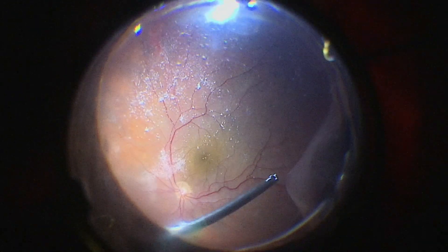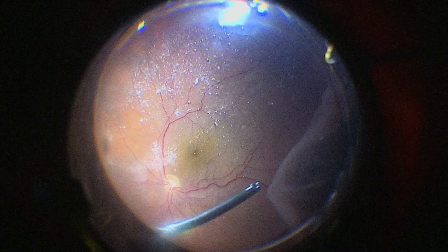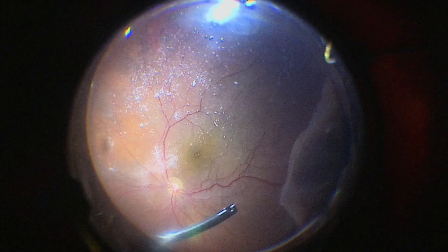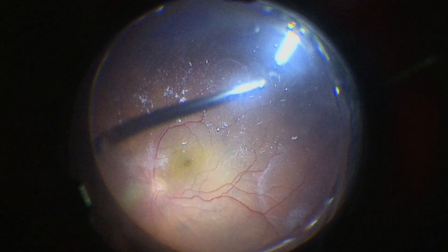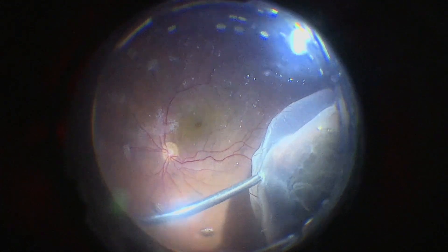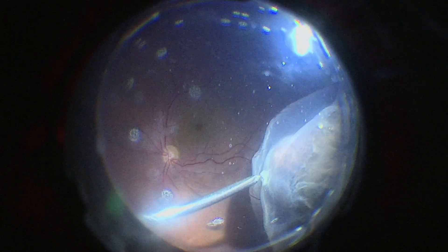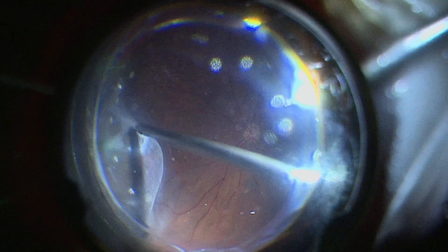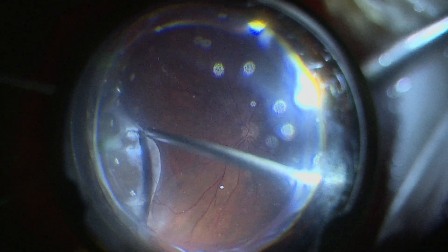Since the patient had a superior retinal detachment with small retinal breaks, the surgeon opted not to use perfluorocarbon to reposition the retina. In these cases, it is crucial to mark the breaks with endocautery, because once the retina is repositioned, it becomes difficult to accurately locate the breaks for endolaser application.